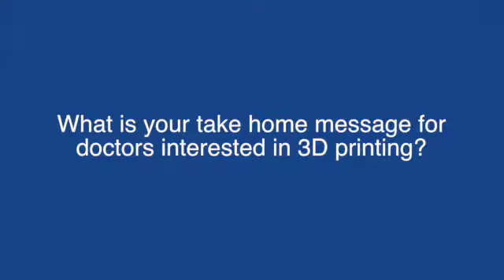Well, for this particular one that was in the press, the prosthesis that was the head of the mandible was titanium. They used a polymer as the glenoid fossa, the space that the joint was fitting into. If you don't have a barrier in that bone, metal prostheses can actually force their way through the bone, so there's a polymer placed in the way, so that both the joint space and the joint prosthesis were printed up using two different materials. Watch this space.